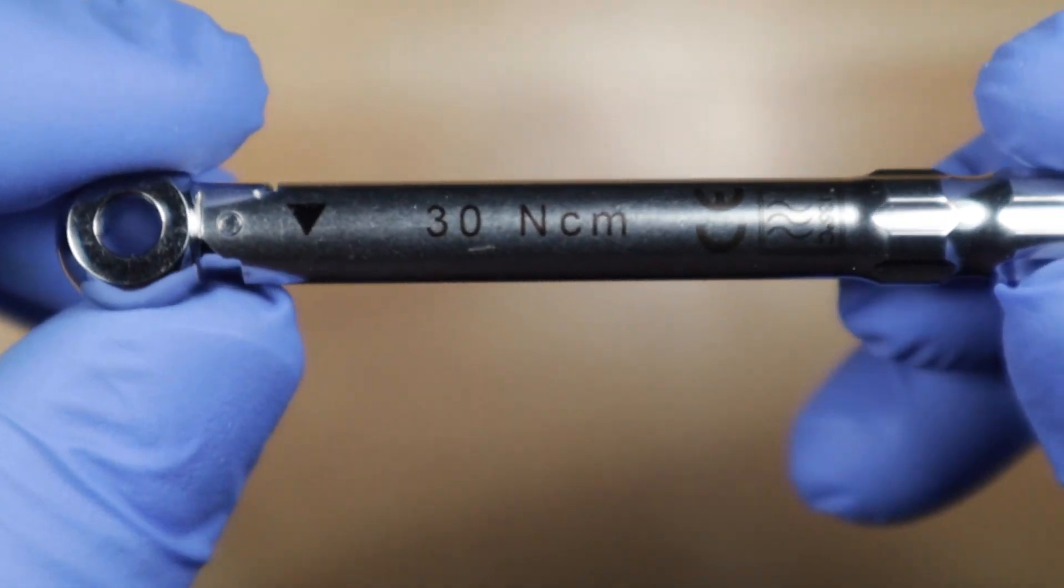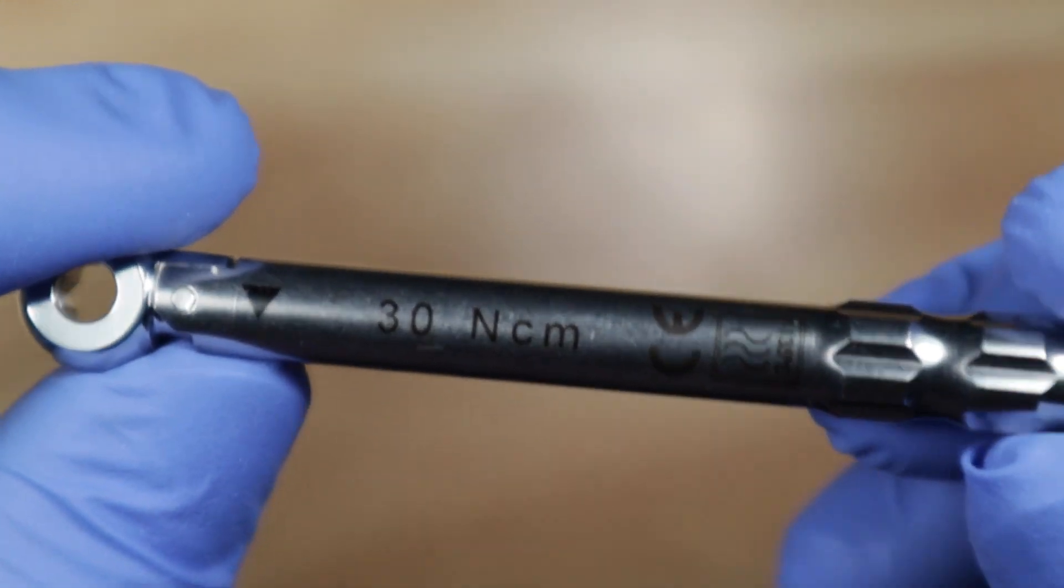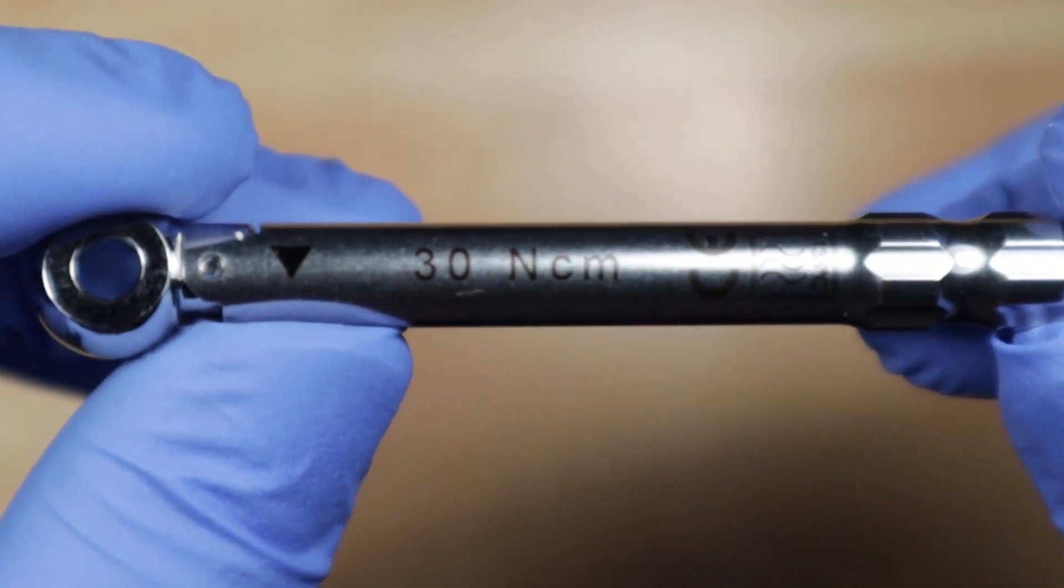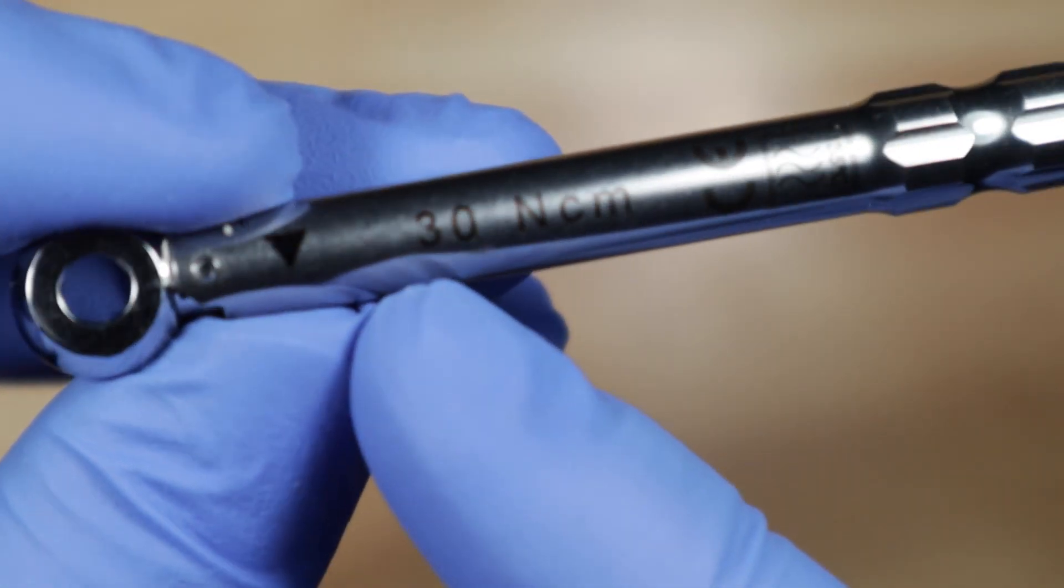So now let's talk about the prosthetic torque wrench. This is the prosthetic torque wrench that comes with the starter pack. So this is a single setting torque wrench. That means it says 30 newton centimeters.